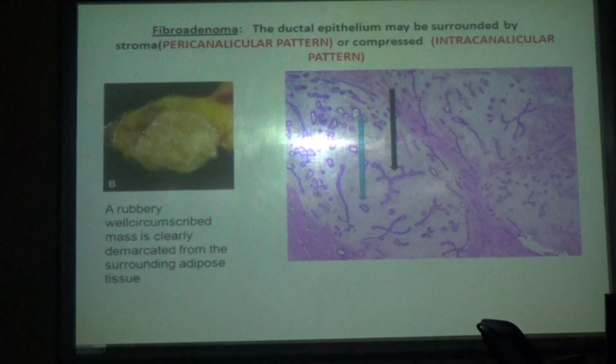Next we'll go for the breast. In breast, we are going to discuss only the last two slides, only about two tumors. One is a benign tumor, another is a malignant tumor. Coming to the benign tumor, one is fibroadenoma. It's a benign tumor of the breast.